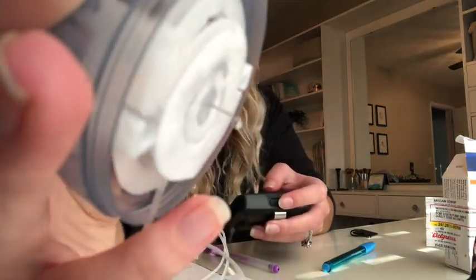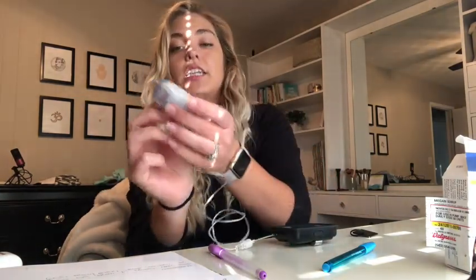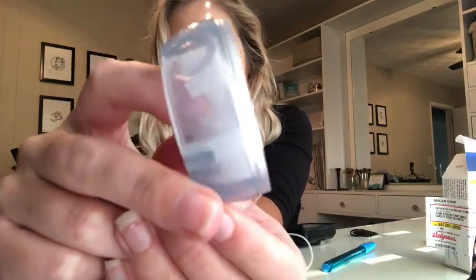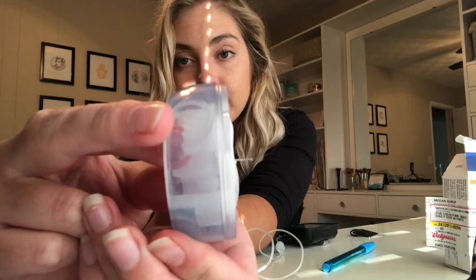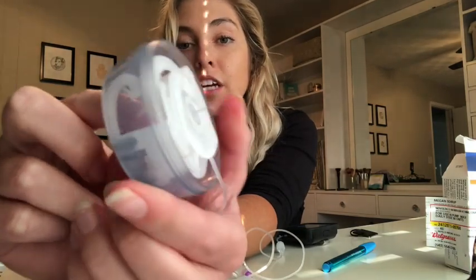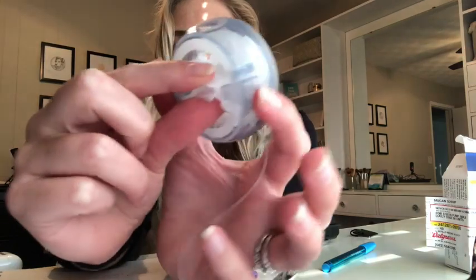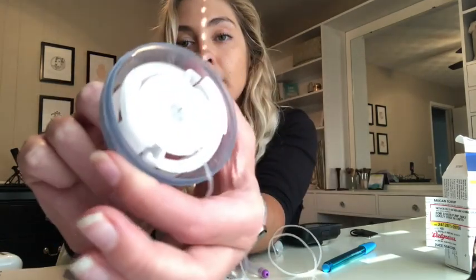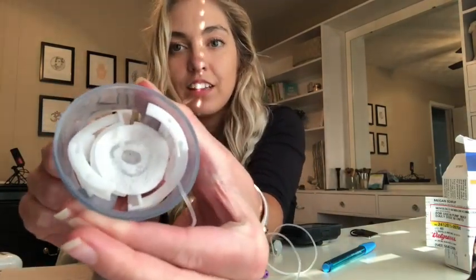Okay, so there's a few drops. So I'm gonna stop it. And now it is detecting, I don't really know what it's doing right now. It's making sure that insulin is in the tubing. So while that is doing its thing, there's two sides to this insertion site. So this is like a lined side, and then this side is where you actually press to insert it into your body. So you don't want to press or hold this side until you're ready to insert the site. So I'm going to hold both ends that have the line. And then there's two little areas to grab, and you pull inward and lock.